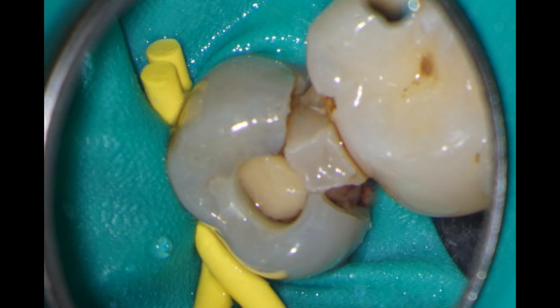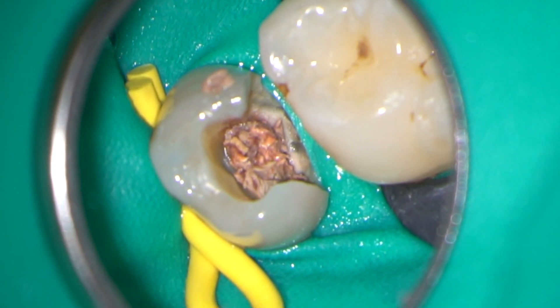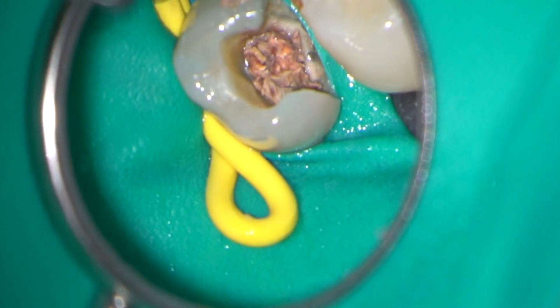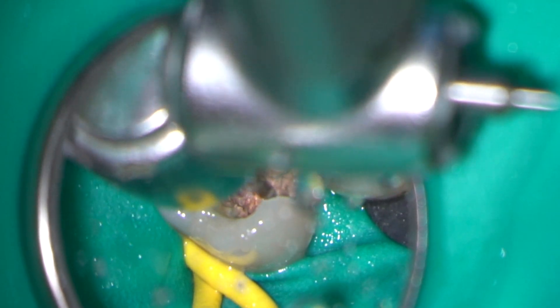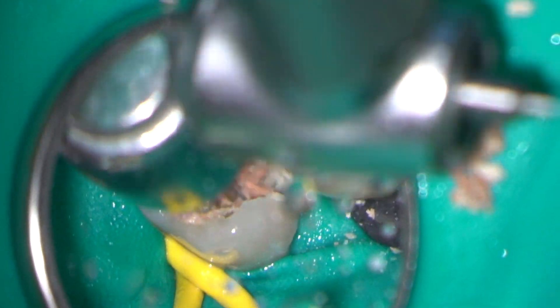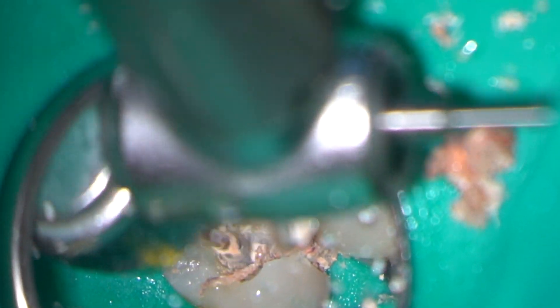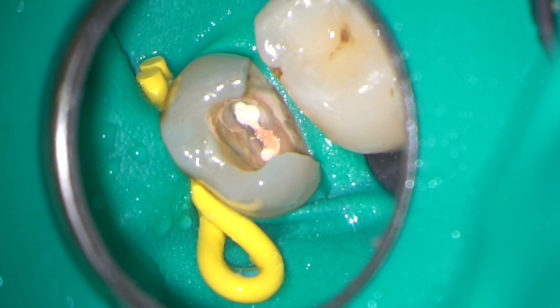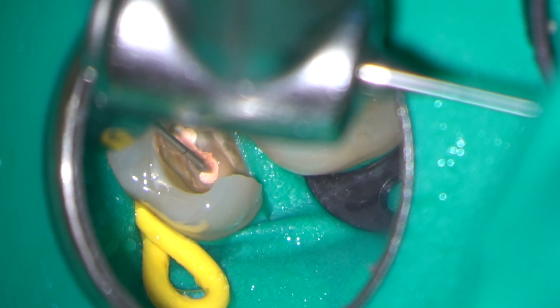The pre-operative view shows the previous access cavity and failing restoration with caries. The restoration was removed using a long tapered diamond burr, and excess GP and caries with an LN tungsten carbide burr. I am now starting to remove the gutta-percha from the coronal part of the root canals using a Gates Glidden number two.